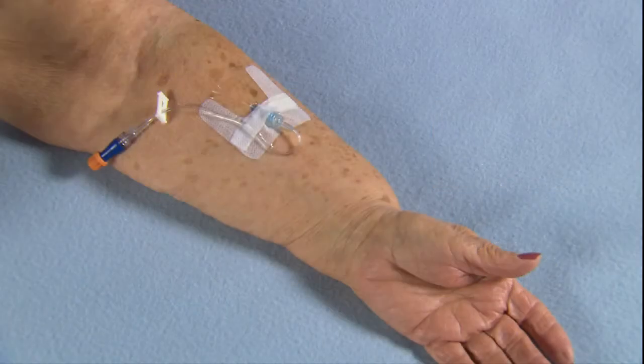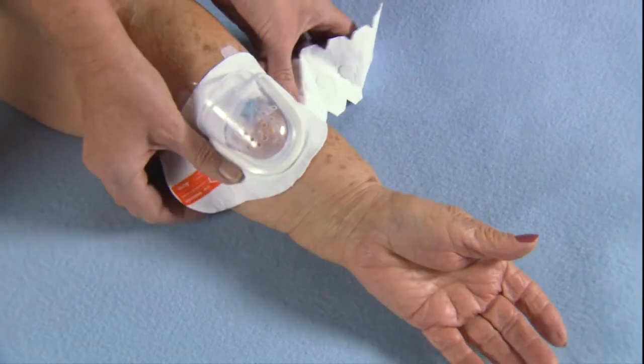Secure your IV site according to your hospital's policies and procedures. Following IV insertion, tape the loop of tubing small enough so that it will fit inside the inner curve of the dome.